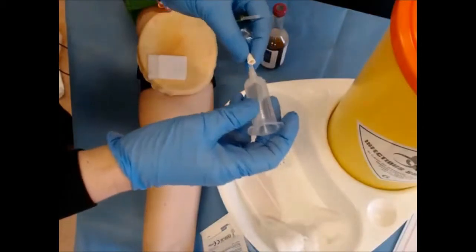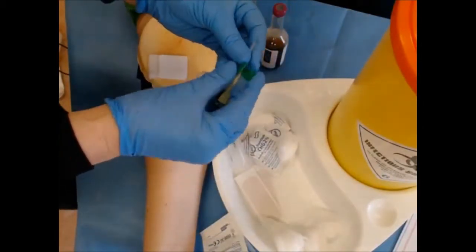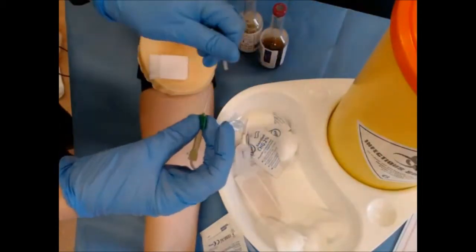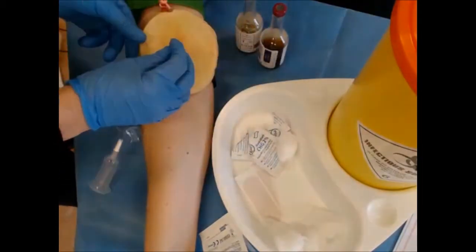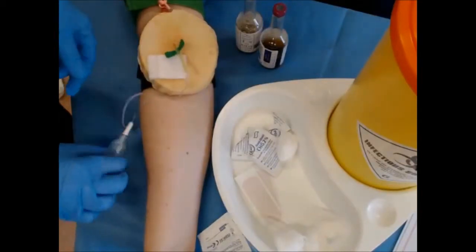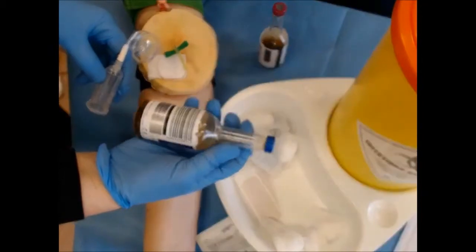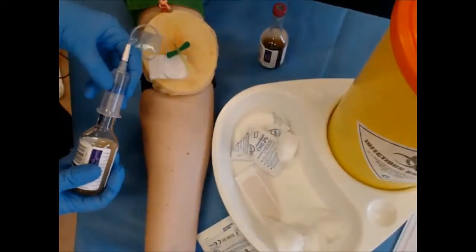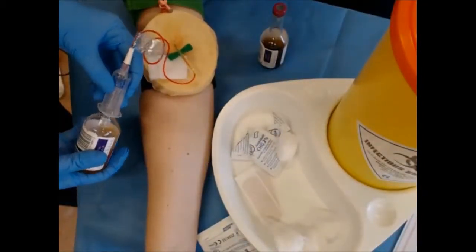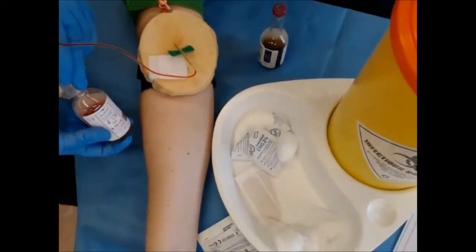OK, so open up your butterfly needle, just hold the little wings together, make sure that the bevel is facing up, insert the needle into the vein and then take your bottles. So as I said, we fill aerobic first. So connect that and allow. So if you stand your bottle up, you'll see when it reaches the 8 to 10 mil mark.